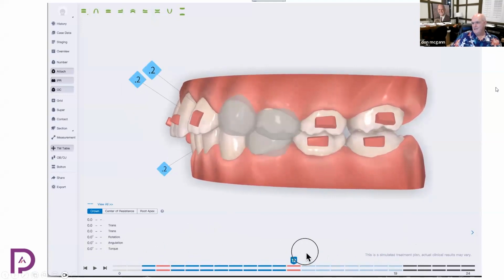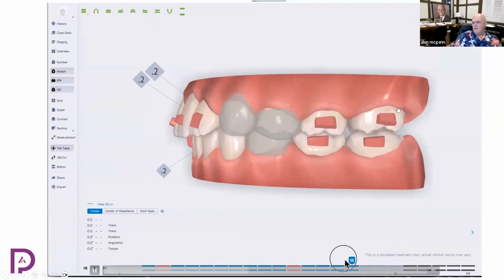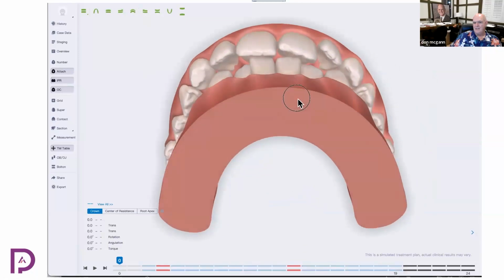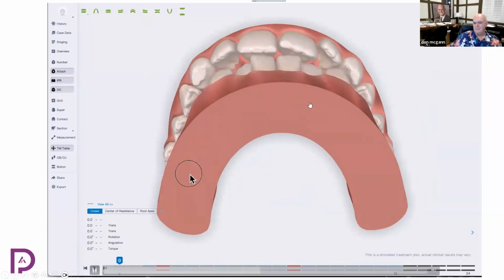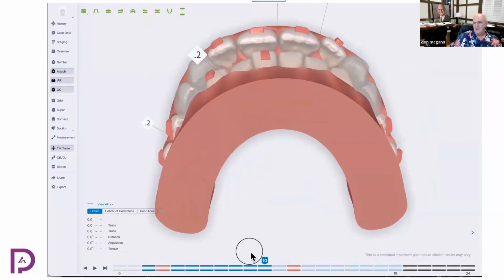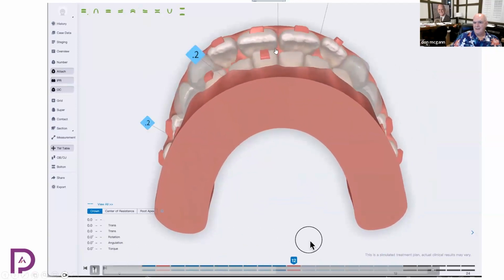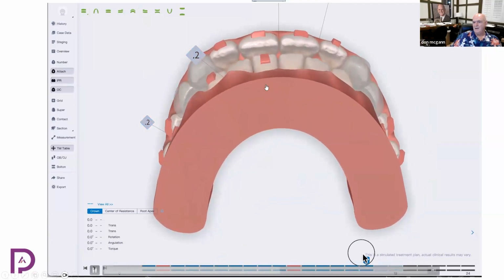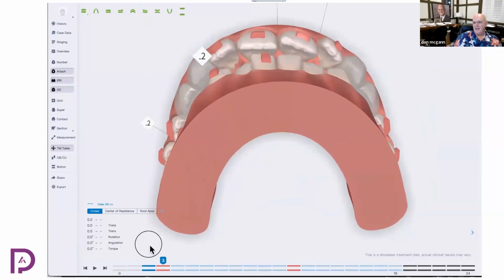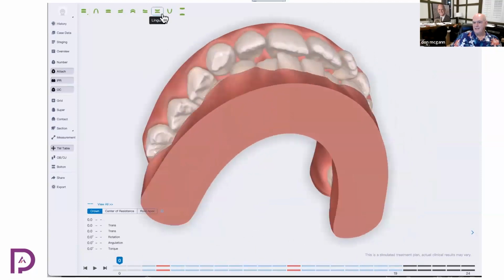So you can see here there's a buccal root torque on the upper molar. So it's in addition to. Oh yeah, here's the overjet. Let's watch the overjet. So you could stop right there, okay, if you wanted more overjet for growth. And then later, maybe some class 2 elastics.